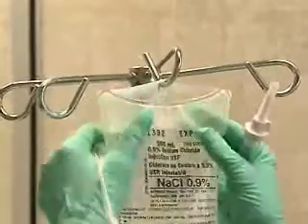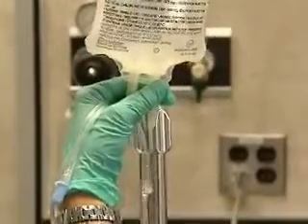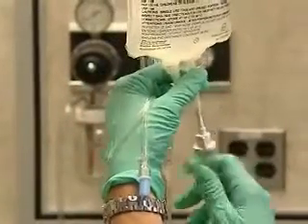The intravenous fluid hangs at the bedside. Remove the protective cap on the sharp end of the tubing and insert it into the opening, being careful not to penetrate the side of the bag.